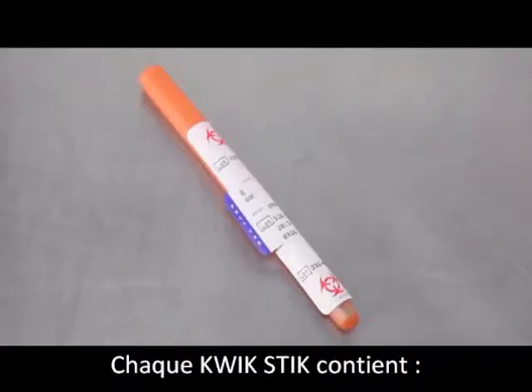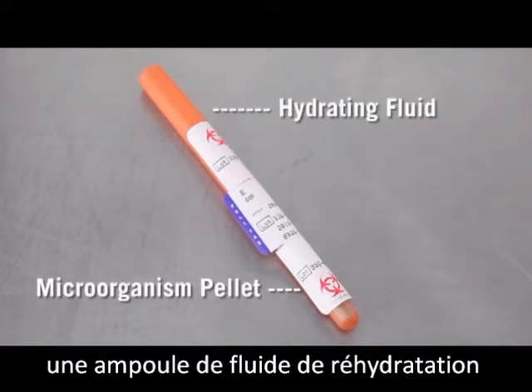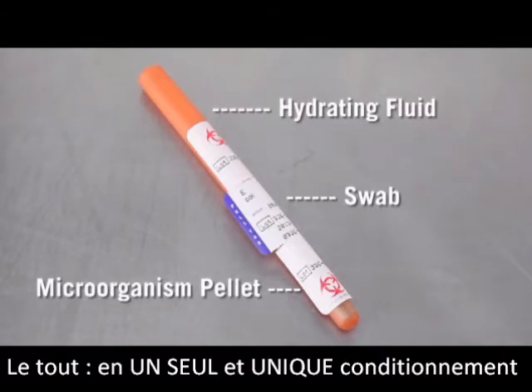Each quick stick contains a single qualitative lyophilized microorganism pellet, an ampoule of hydrating fluid, and an inoculating swab, all in one convenient device.